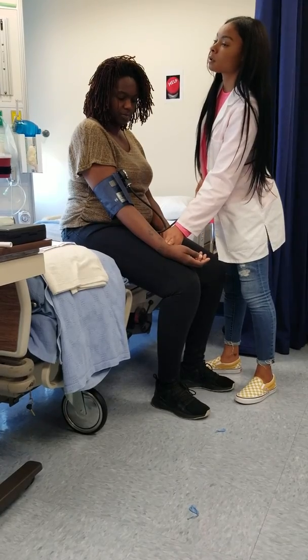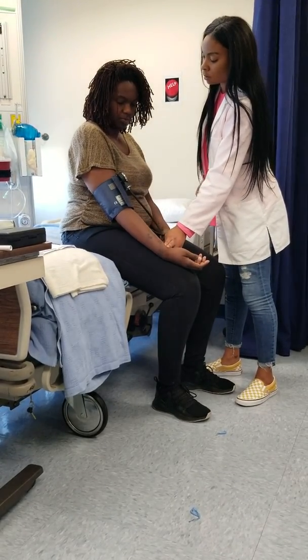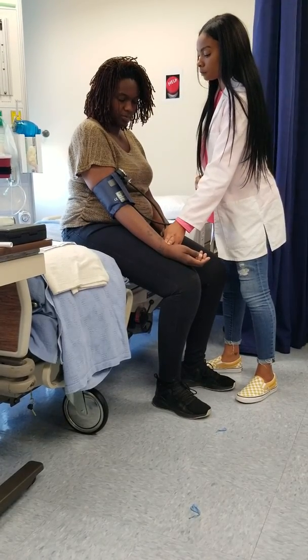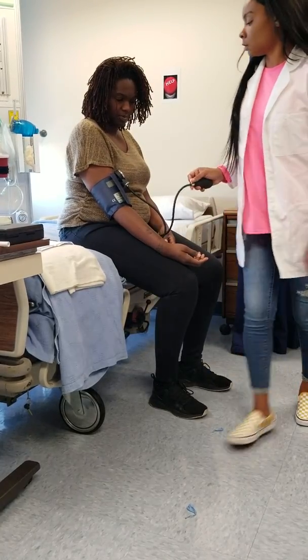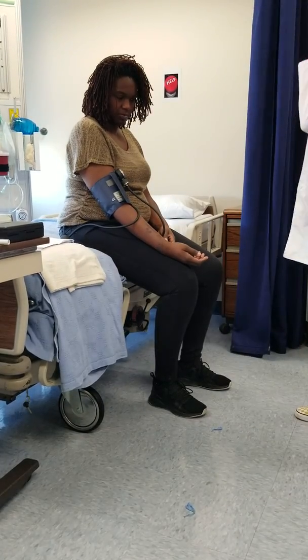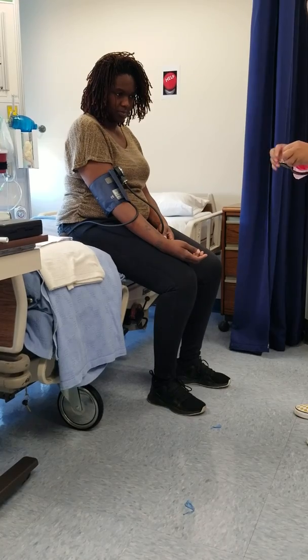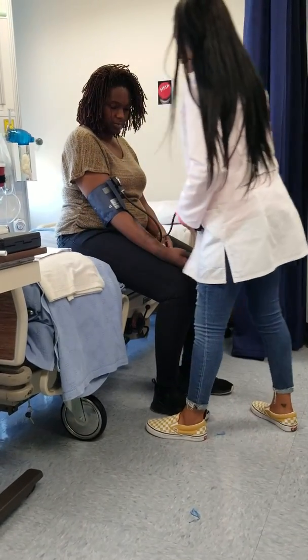I'm going to assess her radial pulse. And I'm going to inflate the cuff until I can no longer feel it. And as I manually take her blood pressure, I'm going to place the diaphragm of my stethoscope over her brachial artery and listen for the first and last sound.